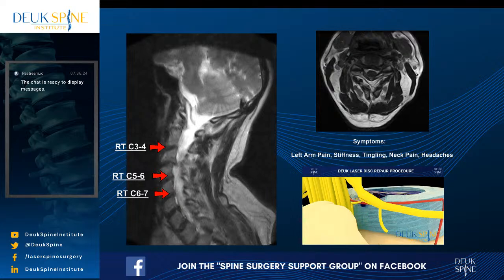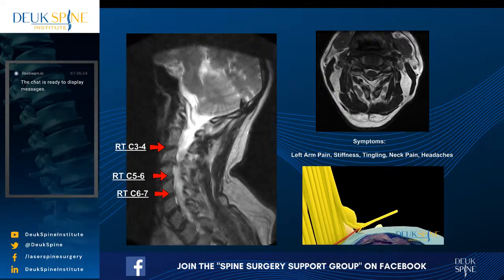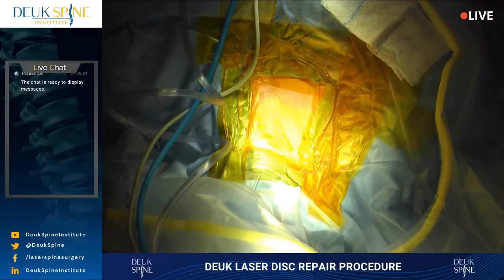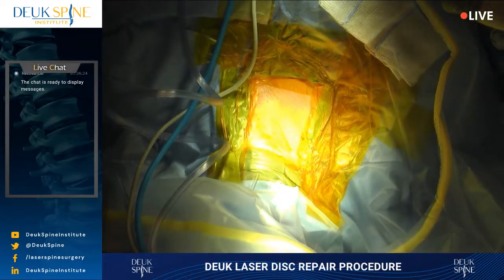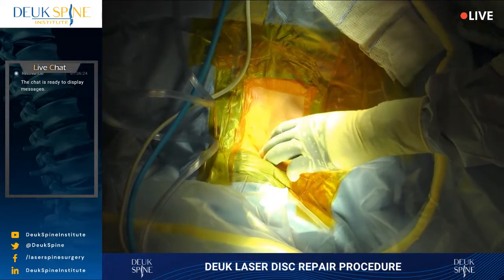The ACDF is an anterior cervical discectomy and fusion. There's a big incision made. We have to move everything over. It creates a massive amount of scar tissue from the surgery, and there's going to be a metal plate in there and fusion of bones. He did not want fusion. So we're avoiding that, and we're going to do 2 tiny little incisions. We're going to repair all 3 discs with 2 little incisions.